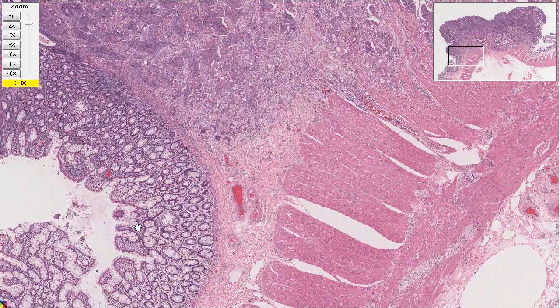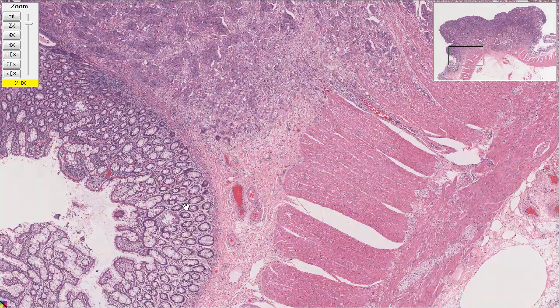This is even not perfectly normal — you can see it's a little bit dividing and a little bit irritated. This is hyperplasia — irritated along the edge.